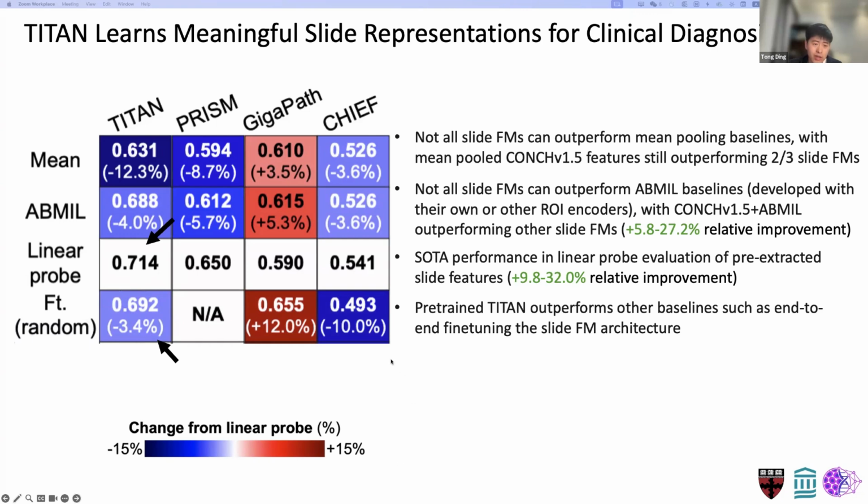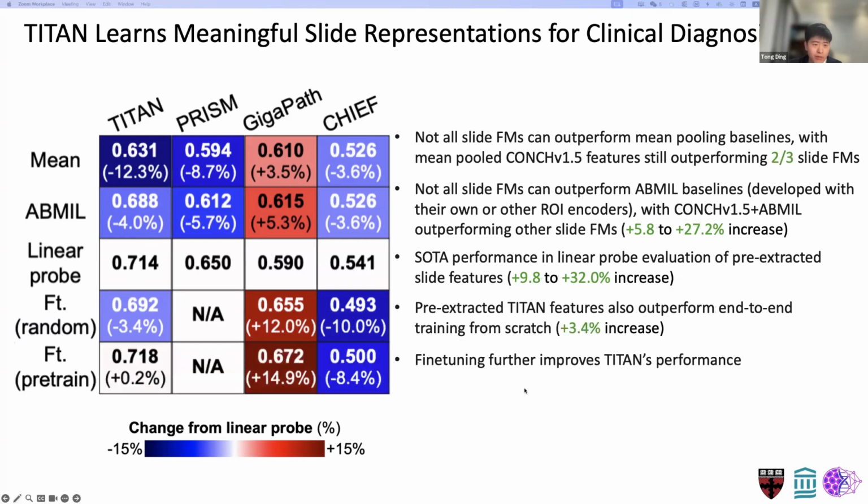And also, not all of the models can outperform their end-to-end supervised training baselines. And finally, we show that fine-tuning of our pre-trained slide encoder further improves Titan's performance.